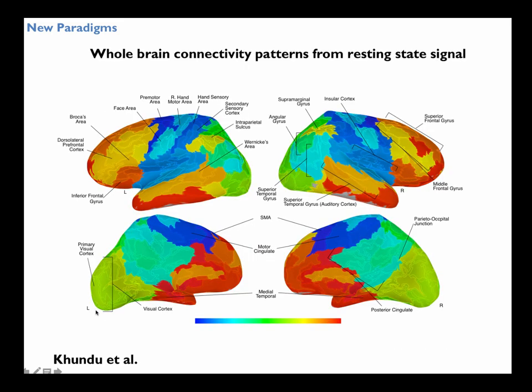All right, so from there, a lot of groups have developed parcellation schemes based on resting state connectivity. And this is using hierarchical clustering. This happens to be multi-echo data, which we have our own way of going about doing. This is work by Prantik Kundu, who was a graduate student in my group at the time of doing this, about 5 years ago. And here he showed that it looks basically like a Brodmann's map now. So from 7 to 10 minutes of resting state data, you can create something that looks like a Brodmann's map in individual subjects.